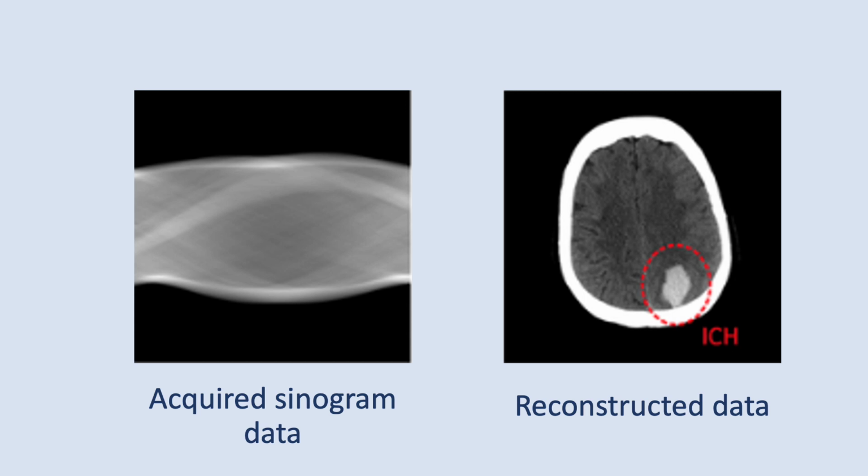But I also want to have the brain parenchyma kind of look pretty to two human eyes, or the bone to be just right, which is that white stuff around the outside. Each type of CT scanner, each company has a different set of filters and magic that they do to try to make the images look pretty for people.